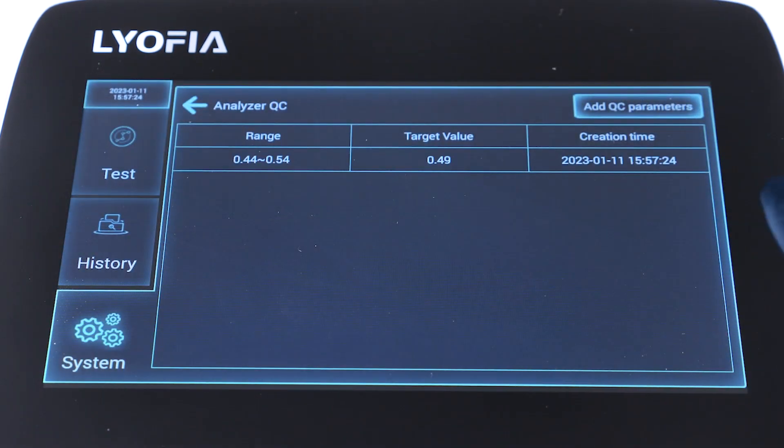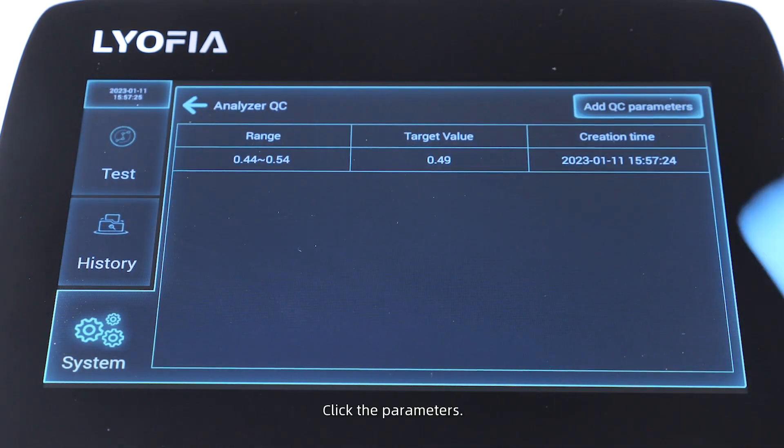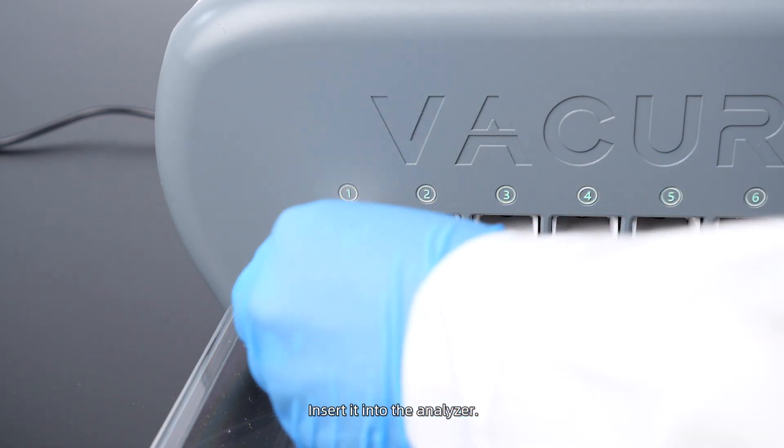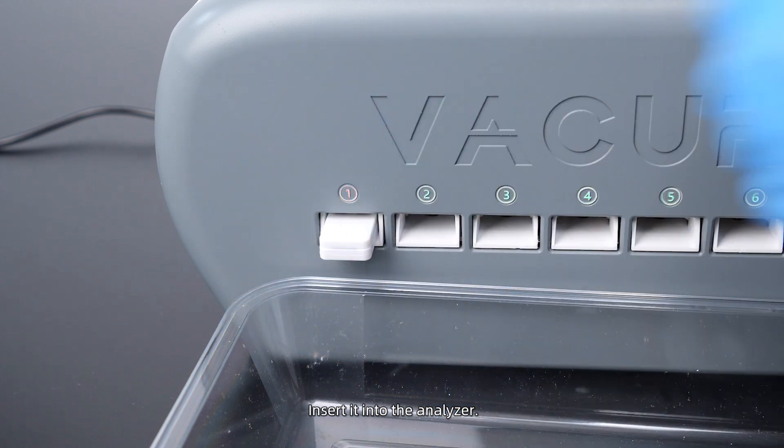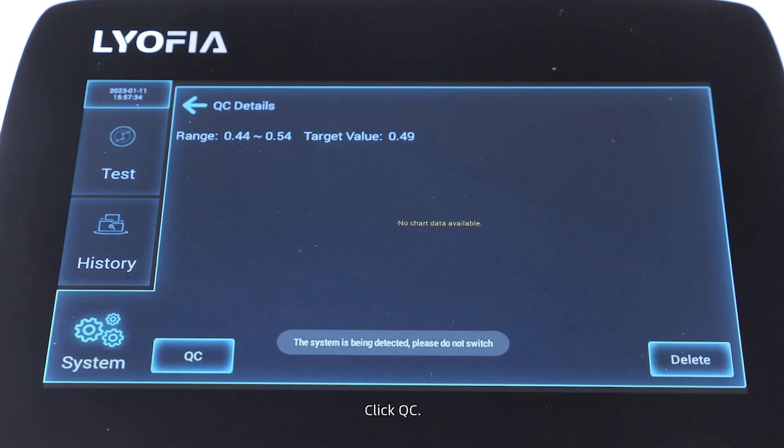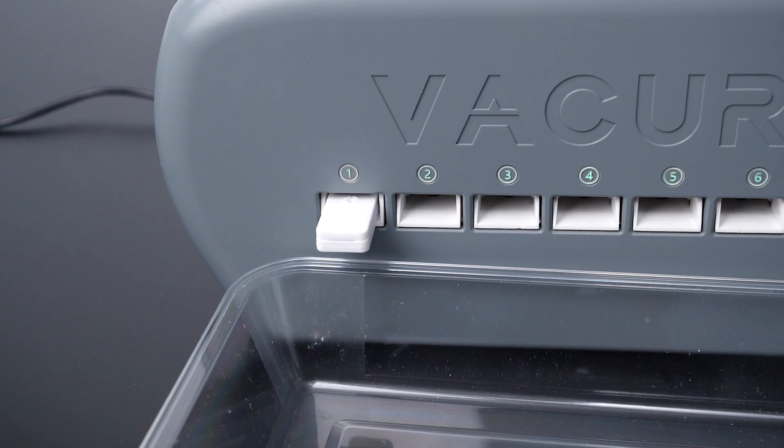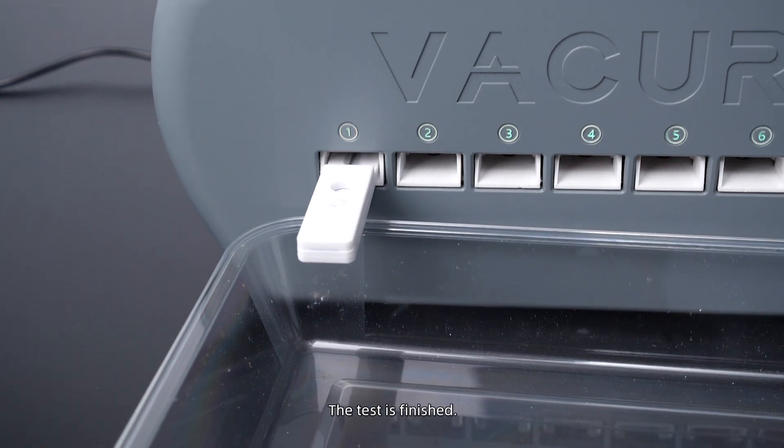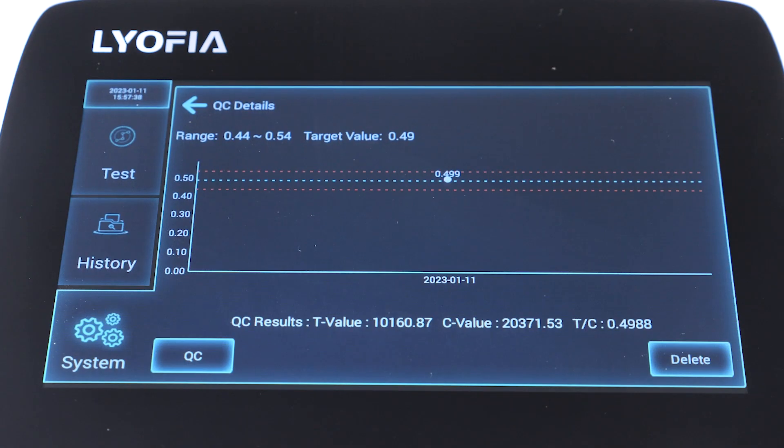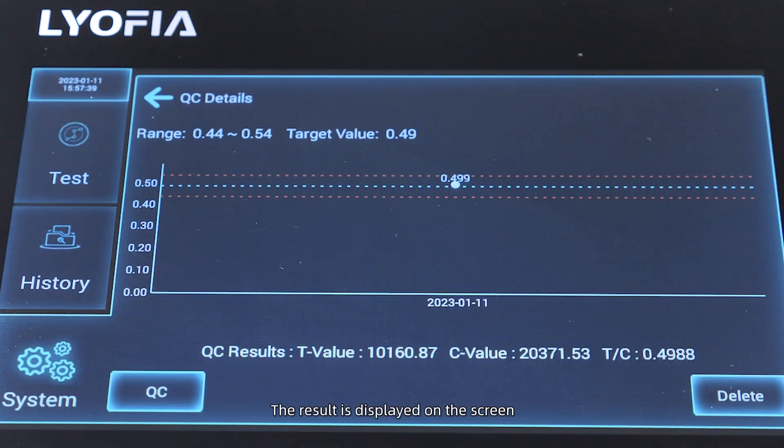Click the parameters and insert it into the analyzer. Click QC. The test is finished and the result is displayed on the screen.